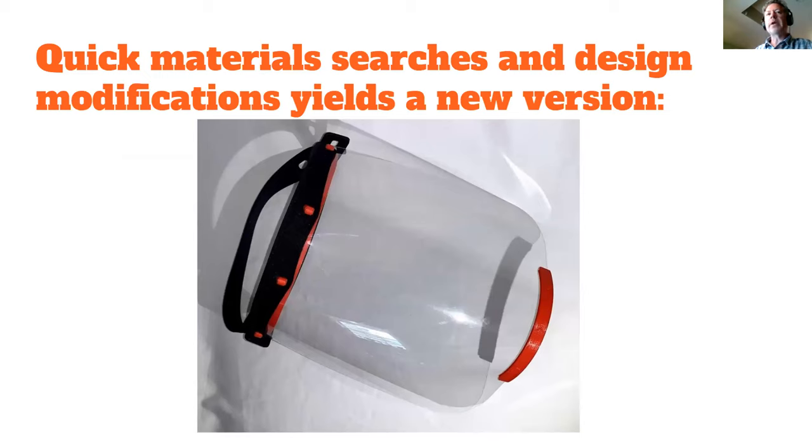which is relatively inexpensive and you can get in huge rolls at pretty discount prices, for both a roof, a cover between the front of the forehead and the front of the face shield, in the same way that you saw in the first design, that 3D printed roof, and also as the back strap. And the hospitals liked the neoprene because it was pretty easily cleanable. They could take it off and wash it and sanitize it. It also served double duty as a membrane between the forehead and the actual plastic, so it provided some cushioning for the clinicians.